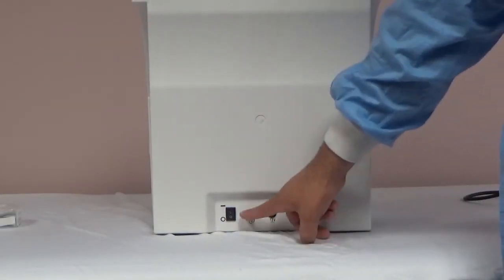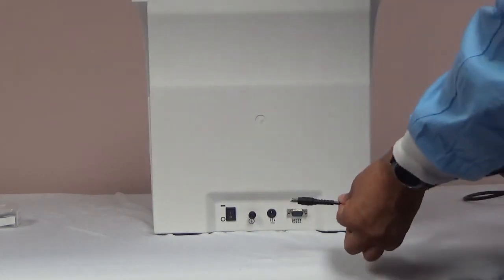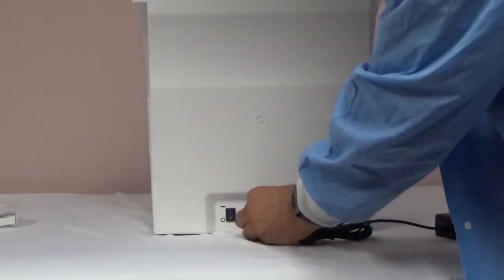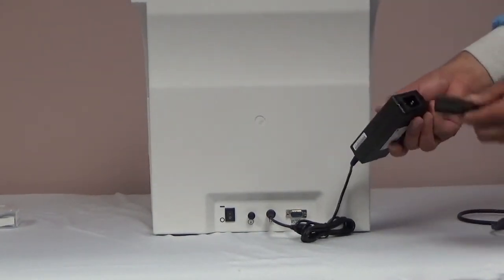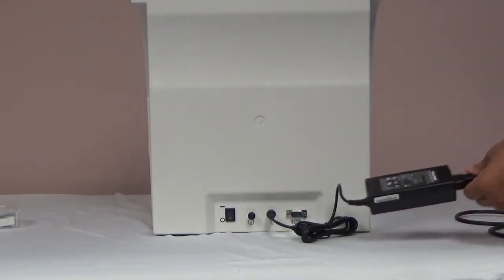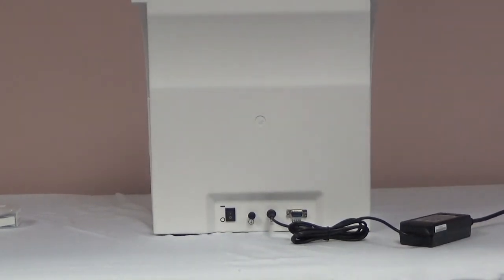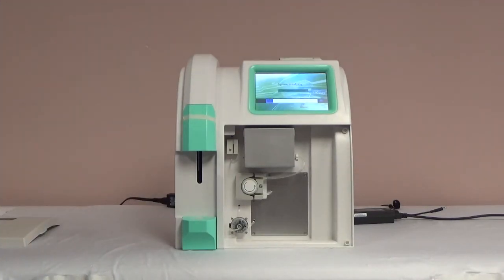Once the electrodes and the pack are installed, you can connect the analyzer to the AC power adapter and connect it to a grounded power outlet. The back of the analyzer has the following connections: power on and off switch, connection for grounding, the AC adapter connection, and the RS-232 for data transmission. Once the analyzer is plugged in, flip the power switch to turn it on.